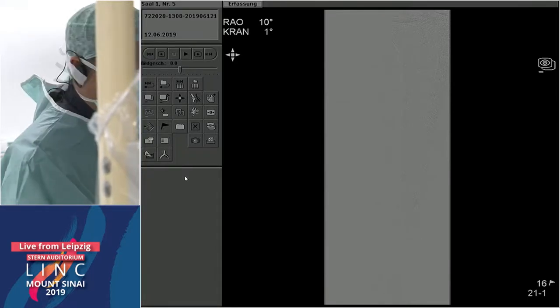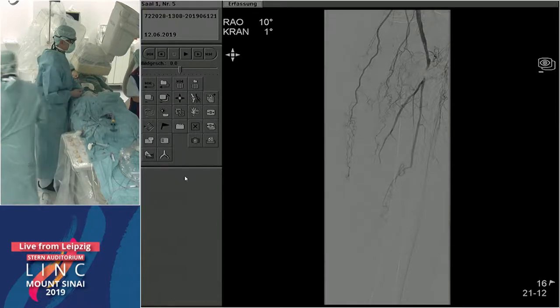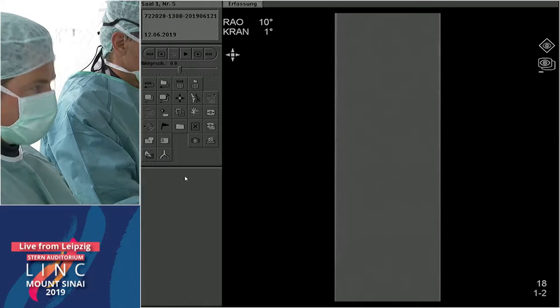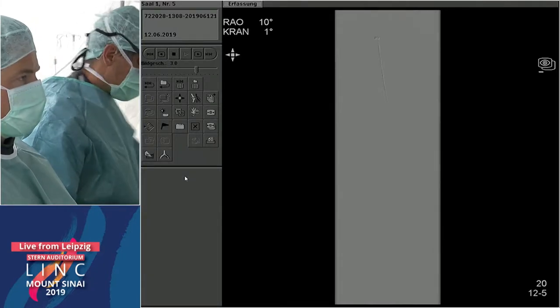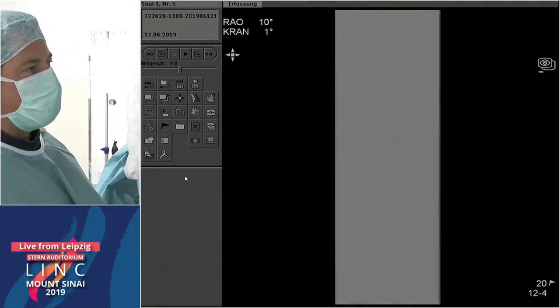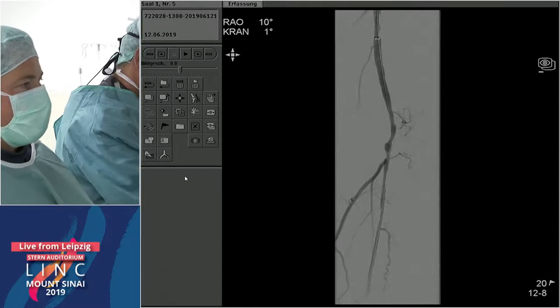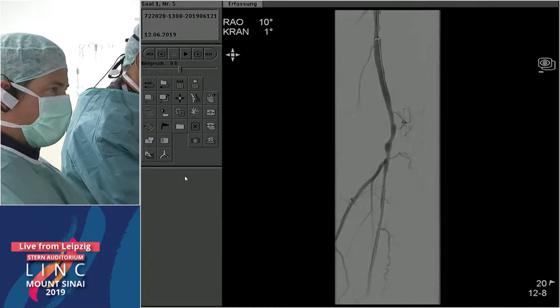Looking downstream, there was a little distal embolization. I used the Rotarex again to treat this. I had only the 6 French Rotarex device available and used it throughout. The thrombus was cleared — it looks like maybe a little too much Rotarex in that area — but no bleeding. So there we are.